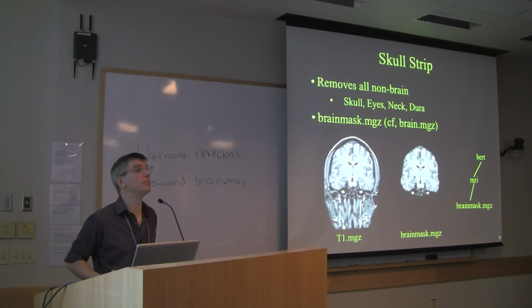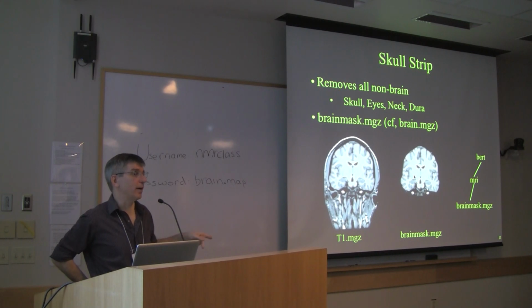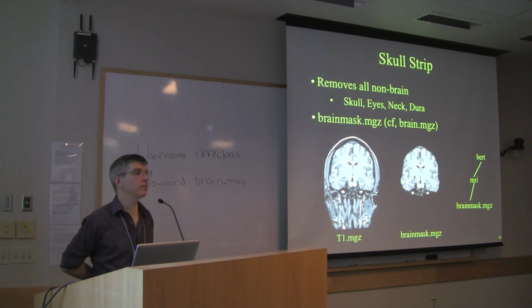Yeah? I've heard skull stripped a few times and had it leave a little cap of skull in some places. Registration seemed to be good otherwise, and so I've always moved forward with those. But is there any problem if it doesn't entirely strip the skull? Is there any problem if it does not entirely strip the skull? Can I defer that question until this afternoon when we'll go through the failure modes?